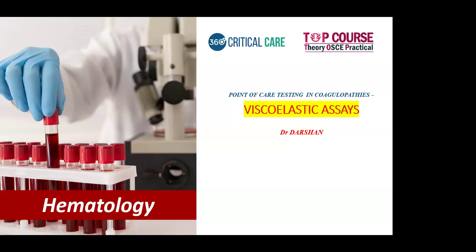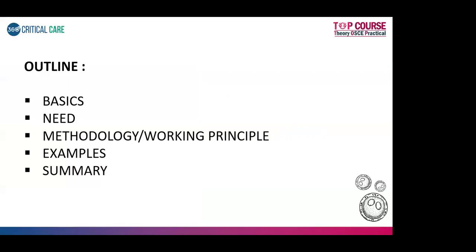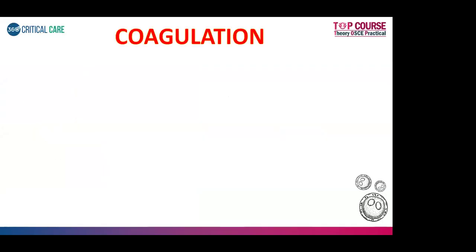So without wasting much time, I'll go directly into the first topic of the day, that is data interpretation on viscoelastic testing. This is something that I've already dealt with in the theory chapters as well. The basic thing is, you need to understand the working principle, where we use it, and a few examples, and then we'll summarize, and what practical questions can be asked when they are giving you a data interpretation based on a viscoelastic test.